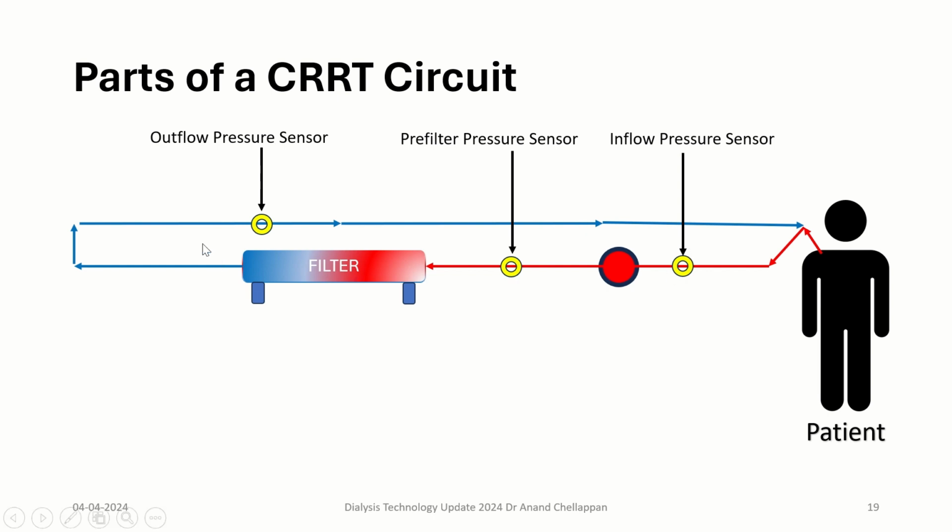Now, this is the blood circuit in the CRRT. Now, we have the dialysate as well. Before going into the dialysate circuit, let us see the anticoagulation, which is heparin, which is given here, and the heparin is given pre-filter. The point to be noted is it is given pre-filter so that it can prevent the clotting in the CRRT dialyzer.